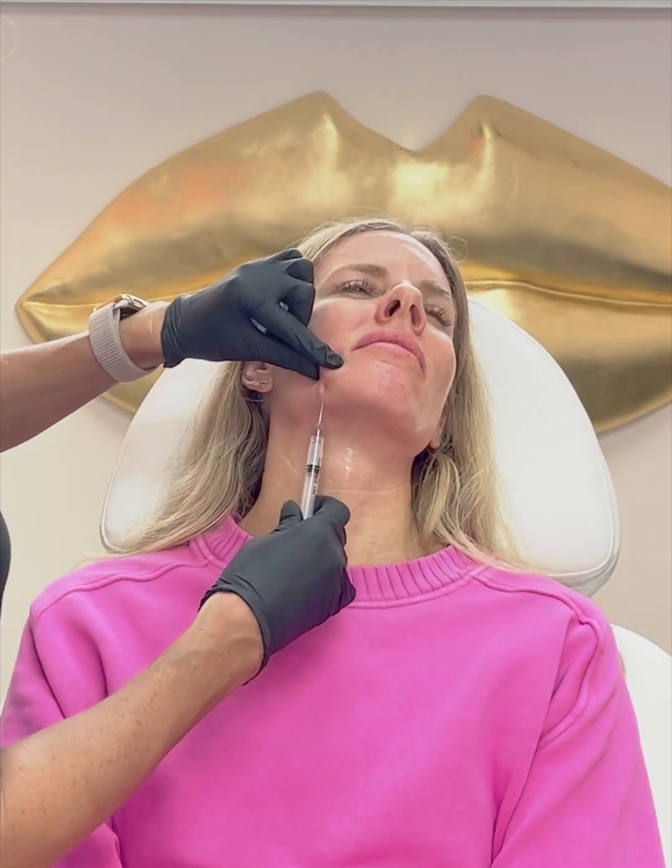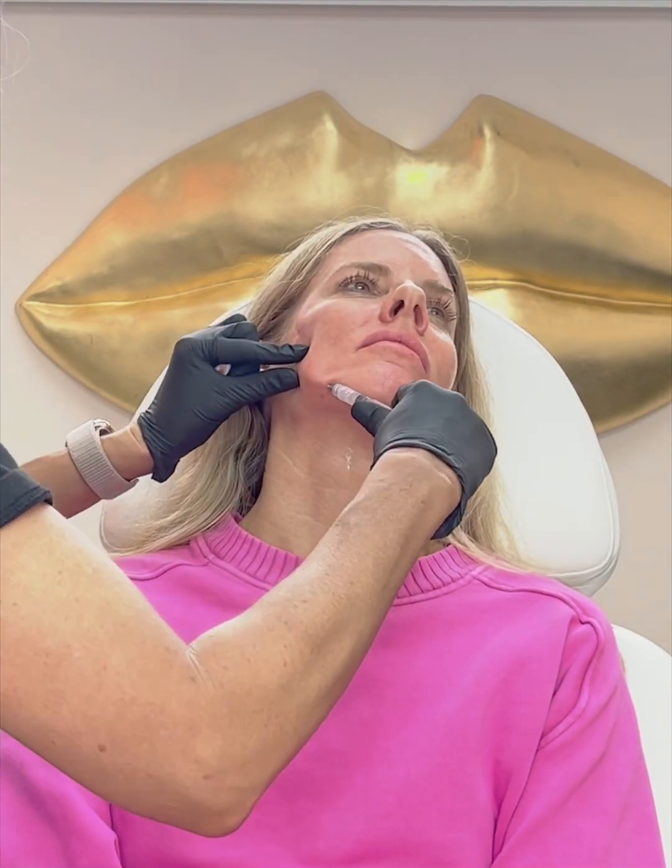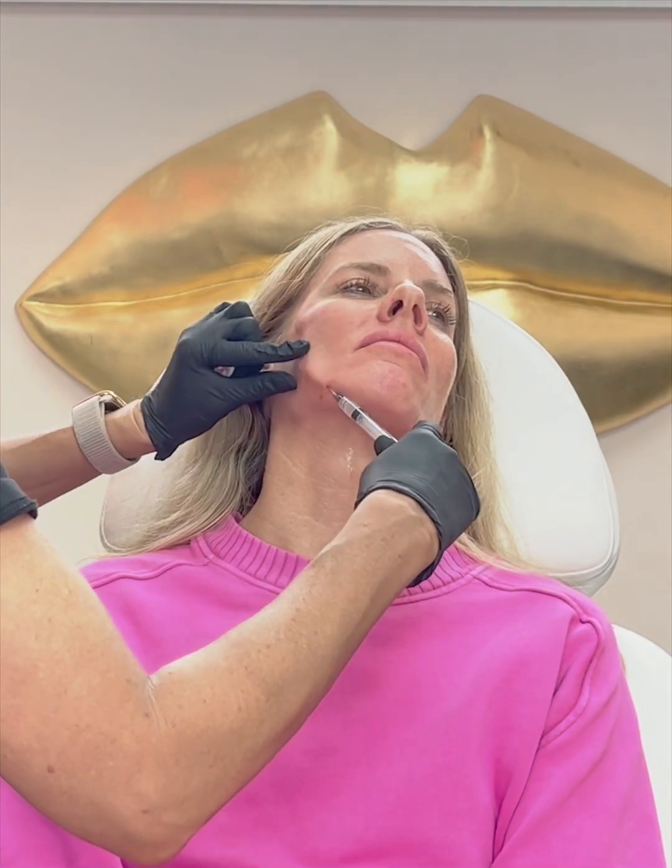Now, Sculptra does come with a little bit different post-care than your hyaluronic acid-based fillers. So it is imperative that you massage the areas that are treated for 5 minutes, 5 times a day for 5 days post-injection. The reason this is so imperative is that we want the actual particles to stay spread throughout the tissue and not conglomerate, because if they do conglomerate, this is putting you at a high risk of a granuloma. And if a granuloma is formed, they are very difficult, if not practically impossible, to get rid of. So making sure that you're massaging these areas post-treatment is so important.